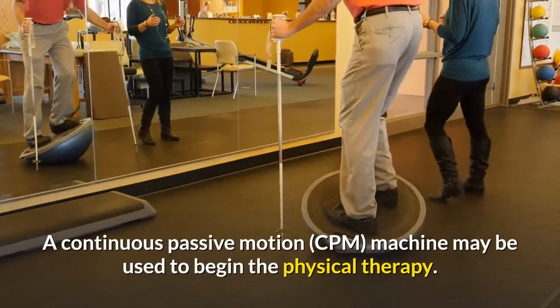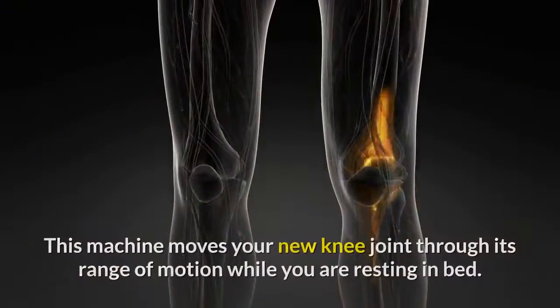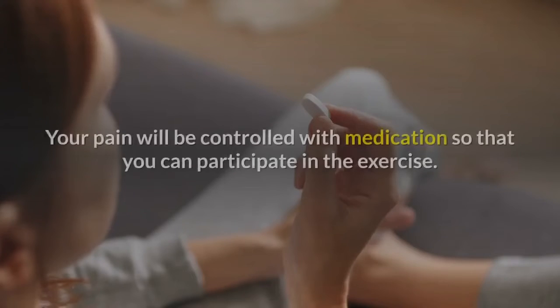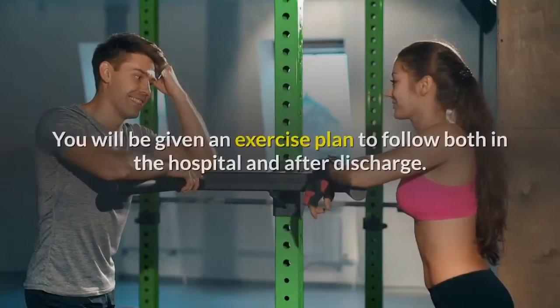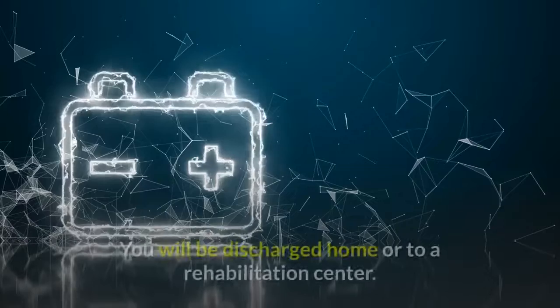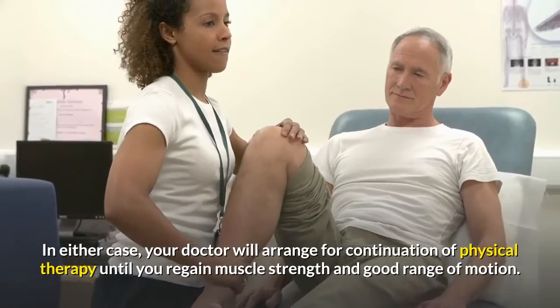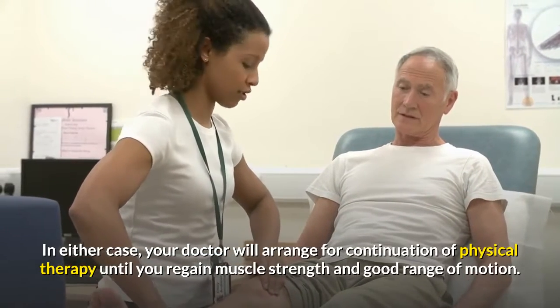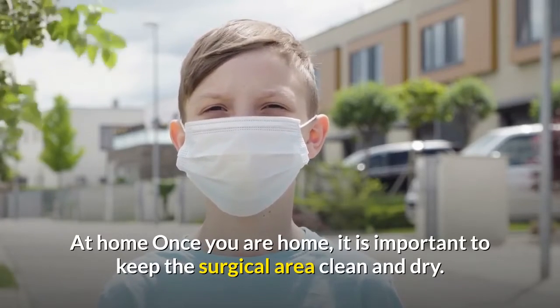A continuous passive motion (CPM) machine may be used to begin the physical therapy. This machine moves your new knee joint through its range of motion while you are resting in bed. Your pain will be controlled with medication so that you can participate in the exercise. You will be given an exercise plan to follow both in the hospital and after discharge. You will be discharged home or to a rehabilitation center. In either case, your doctor will arrange for continuation of physical therapy until you regain muscle strength and good range of motion.